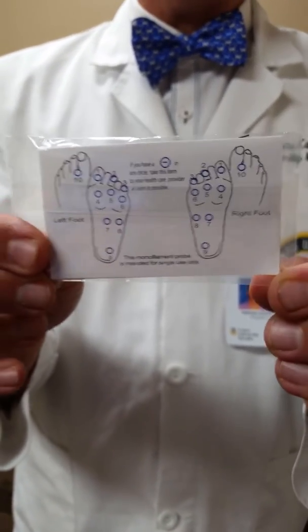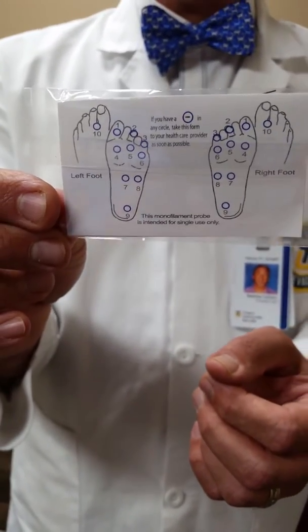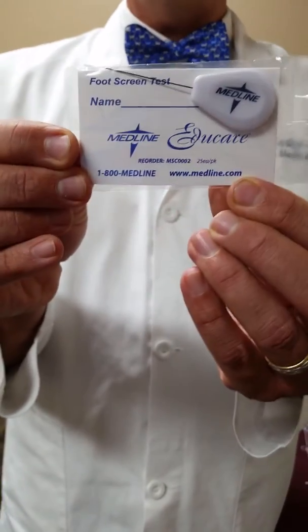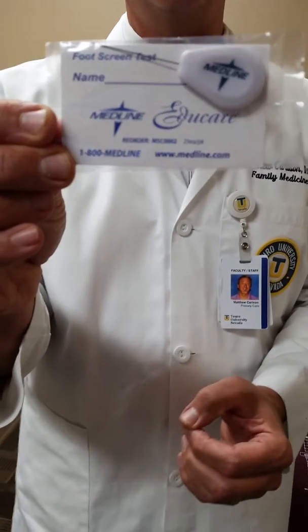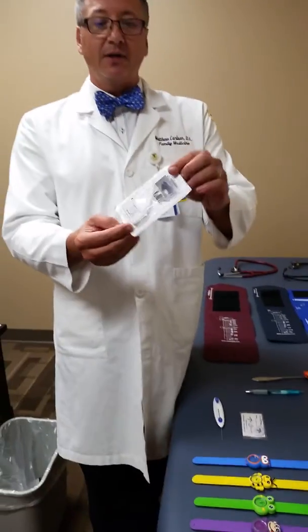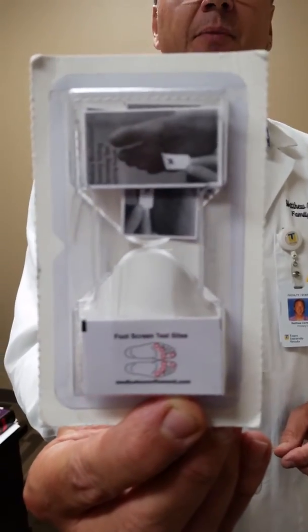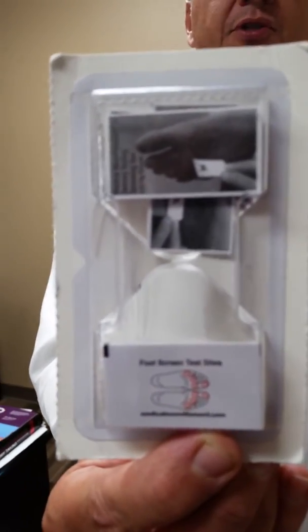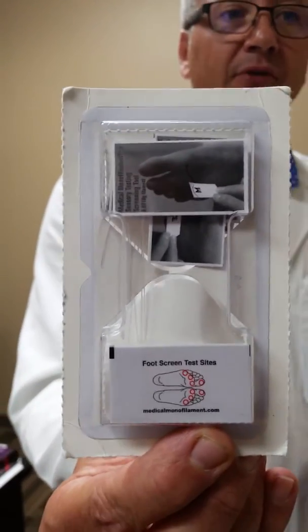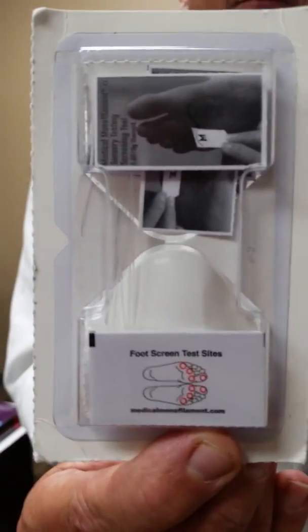Single-use monofilaments come in boxes of 20, 40, or 50 and are considered single-use devices. This one happens to be made by Medline — no specific endorsement intended. You can also get multi-pack boxes; this one shows a picture of how to perform the monofilament exam on the bottom of the foot. You'll be using this exam when doing a diabetic neuropathy test or diabetic foot exam.